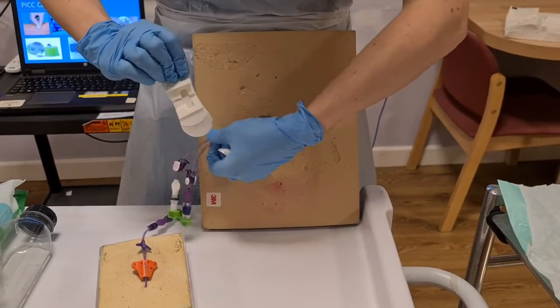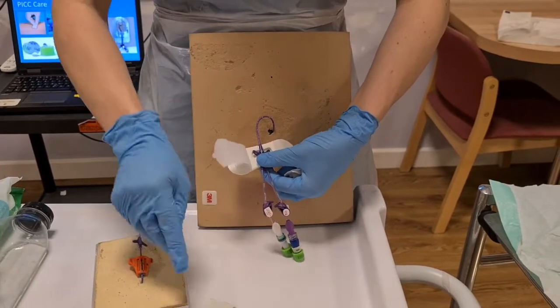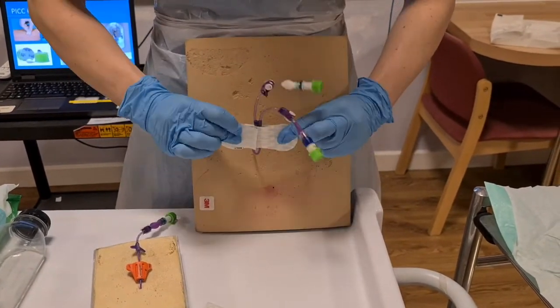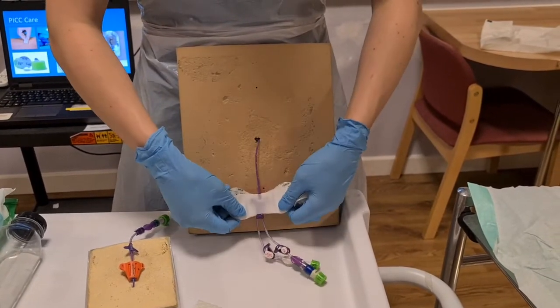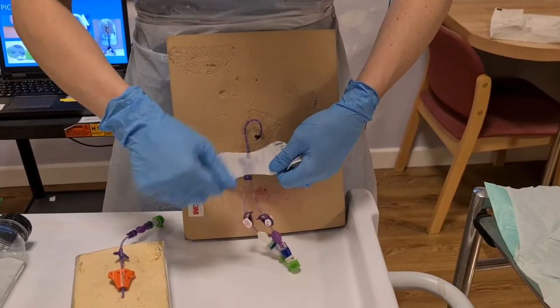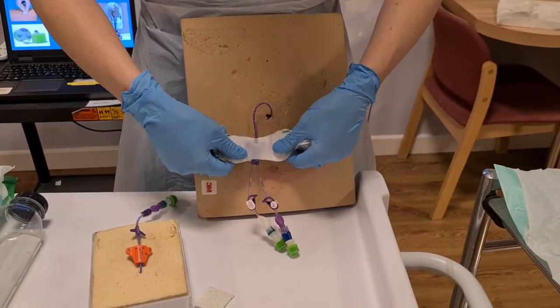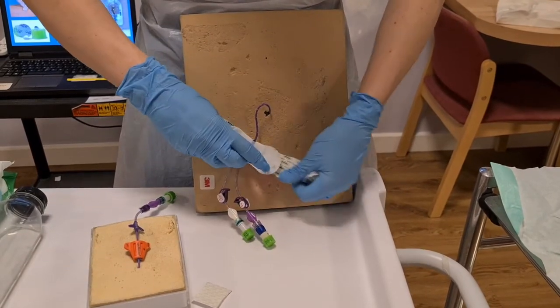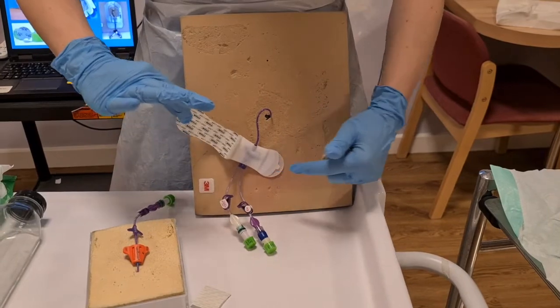Taking the PICC line, inserting it in. Taking that little bit of paper out. Moving across. Underneath you've got two bits of paper, so you can decide where you would like to put the PICC line. Don't overstretch it. You can have it curled, just make sure that the line is not kinked. So I'm just going to place it like so. One bit of paper and then there's another one.